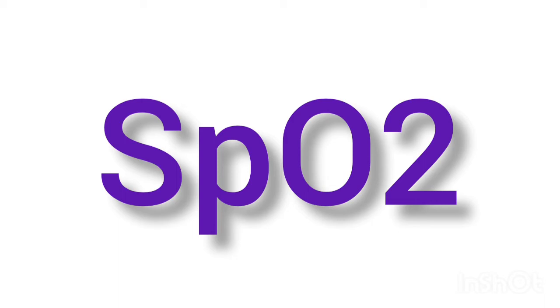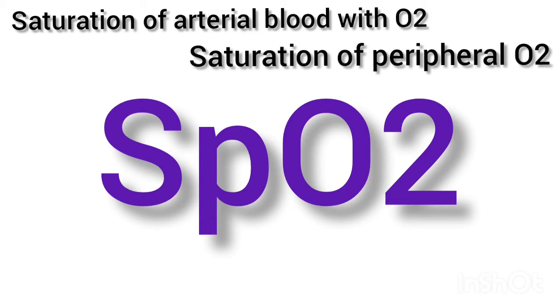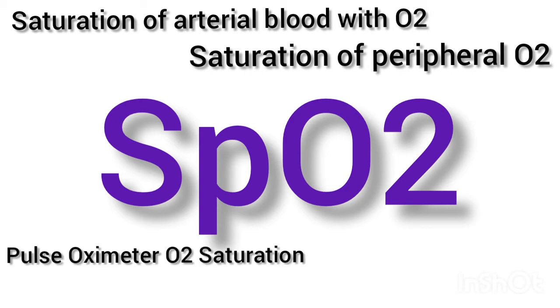SpO2 does not mean any partial pressure of oxygen. It simply means saturation of arterial blood with oxygen, or saturation of peripheral oxygen, or pulse oximeter oxygen saturation, or spot oxygen saturation.